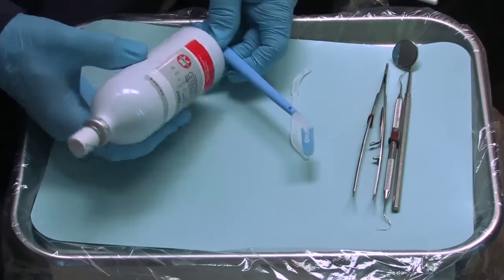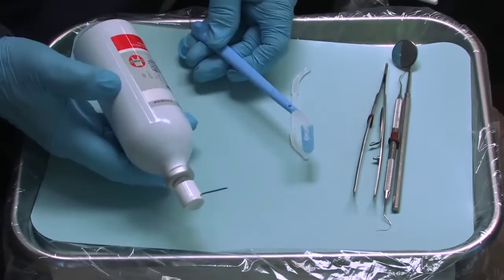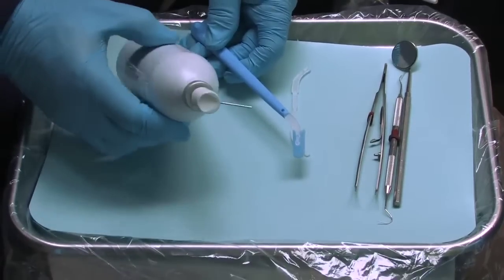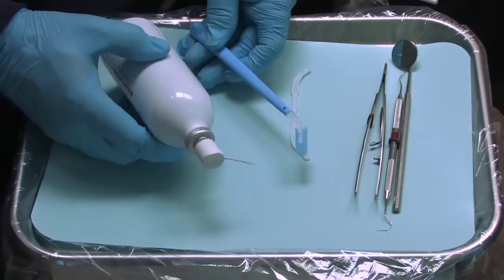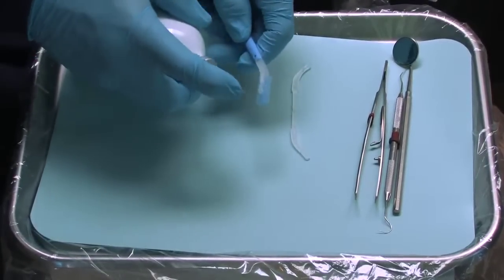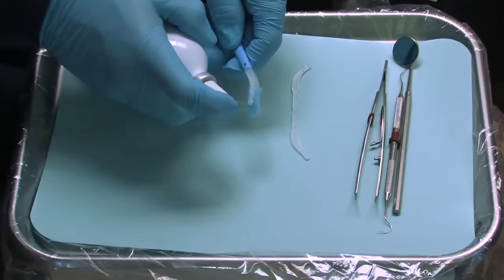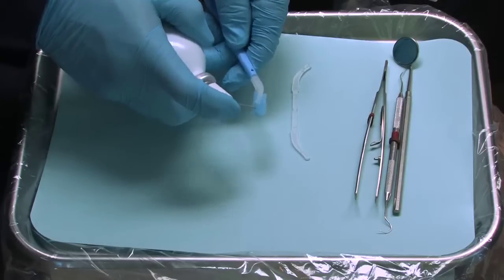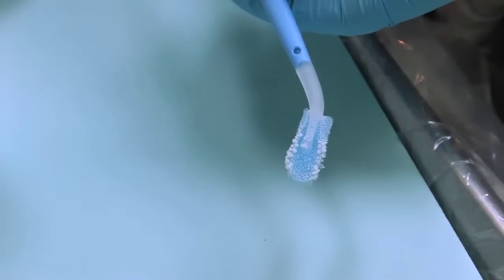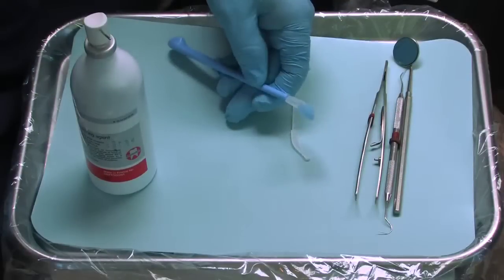Using one of the readily available refrigerants on the dental market, we'll charge the foam tip. The foam tip is an open cell foam which will hold a large amount of refrigerant, allowing you to cold test multiple teeth. Away from the patient, apply the refrigerant to the foam tip by spraying onto the foam on all sides. You will notice that the foam tip becomes frosty, indicating that the evaporative process is cooling the tip.